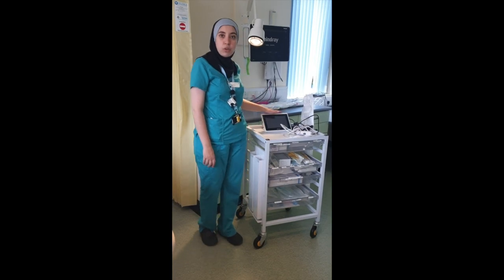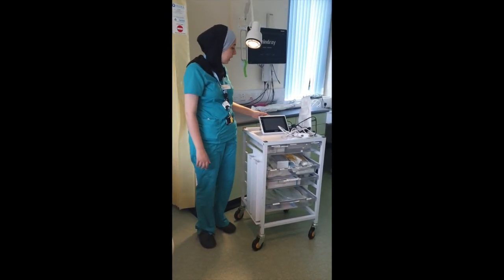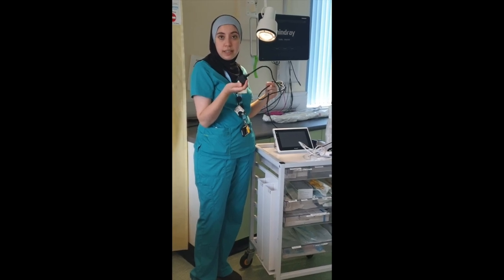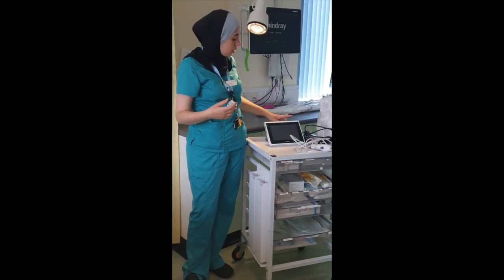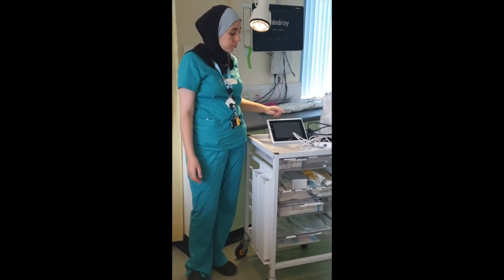On the top of our trolley we have the Ambu screen. Normally this is plugged in to the wall, and ideally once you remove the trolley, unplug this first, and then when you've brought it to the bedside you can plug it in again. You can switch it on with this button at the top here.